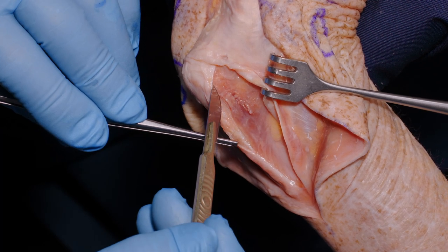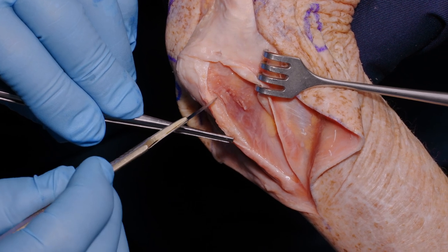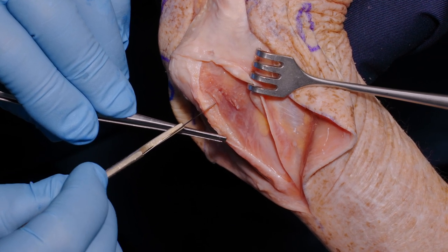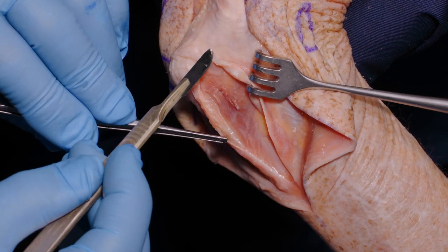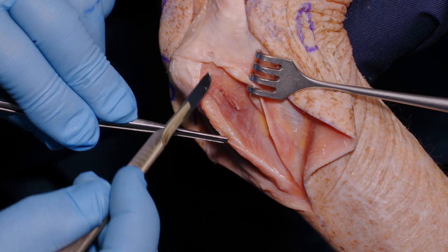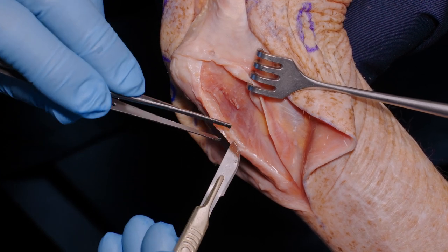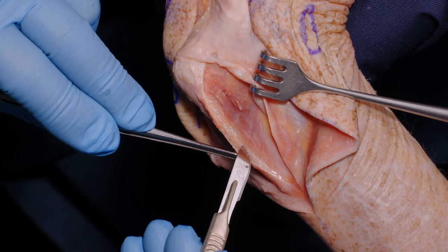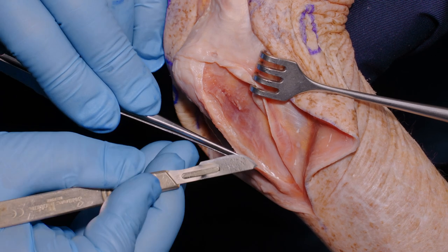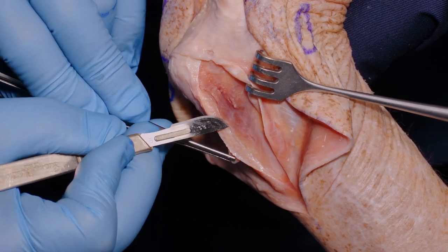We're not going to dissect more proximal than this because our osteotomy is going to be at approximately this level, but we want to include the anconeus in the triceps because anconeus should be considered as part of the triceps in its functional relationship to elbow stability and elbow extension.